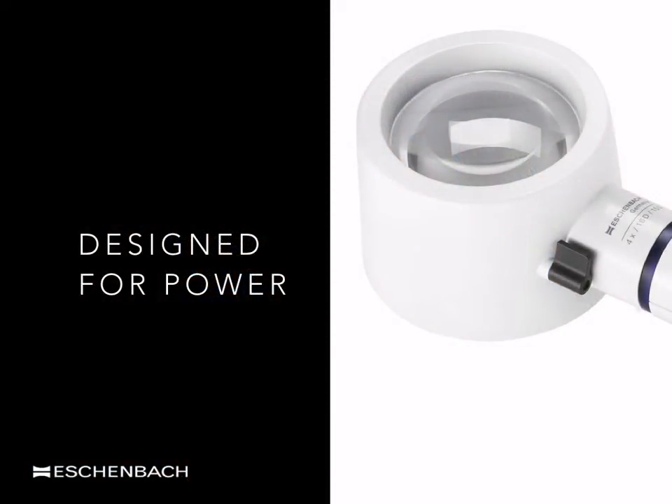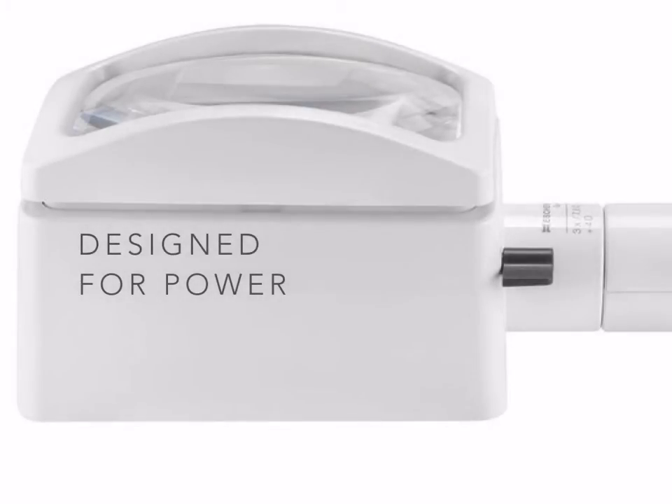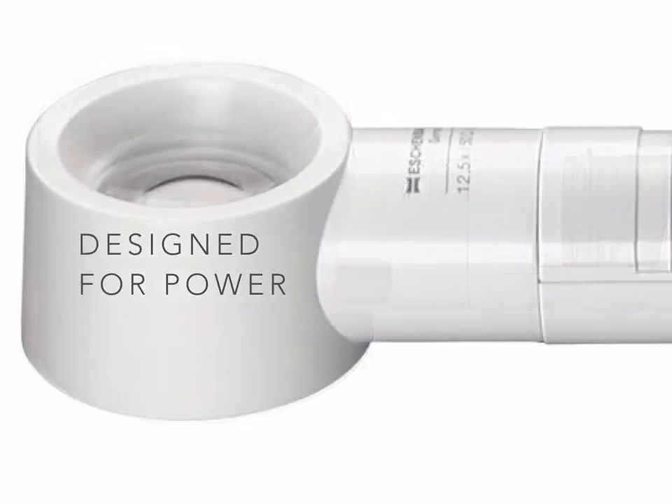In being able to keep the lens at a fixed distance, it also follows that stand magnifiers are available in a wide range of powers. The popular System Vario system has the widest range of powers of all. In the lower powers, lenses are rectangular, while in the higher powers lenses are generally circular. This 12.5x stand magnifier is amongst one of the strongest available optical devices. At this power, the diameter of the lens is smaller; however, with good quality optical design, the image of the print beneath is sharp enough right out to the edges of the lens.